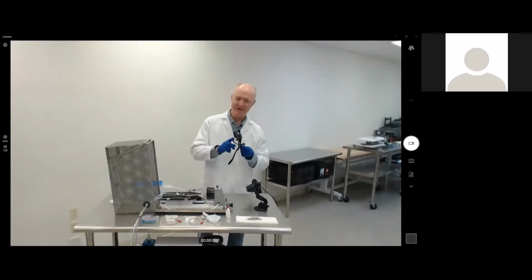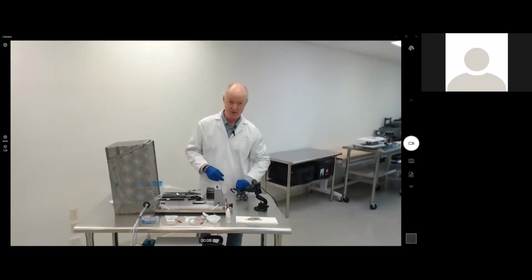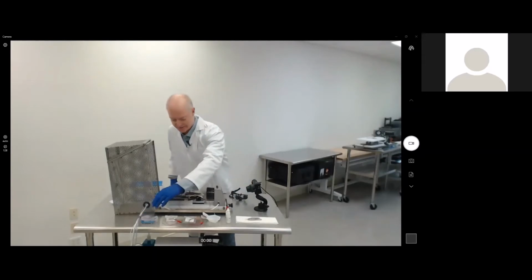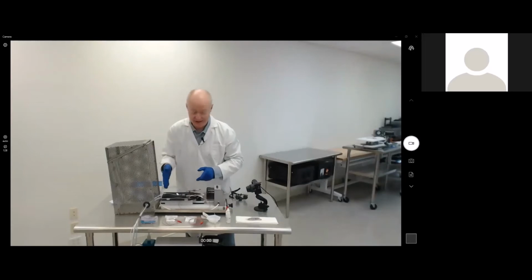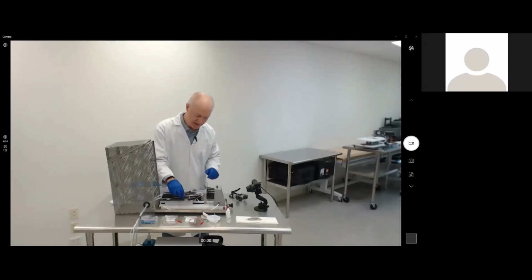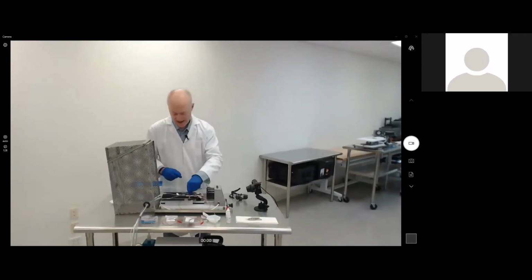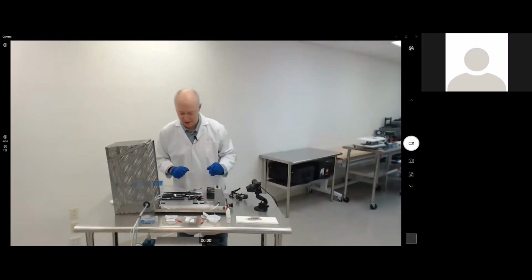Depending on who's doing it, you may want to have different types of accessories that make it easier for you to be able to see. We have tape as necessary. As you can see on the table, I have everything laid out. I have my active electrodes and their little contact lenses here. I have the reference electrodes in place here as well. I have the ground electrode in position as well as the probe. So everything is ready and prepared for me to conduct the ERGs.